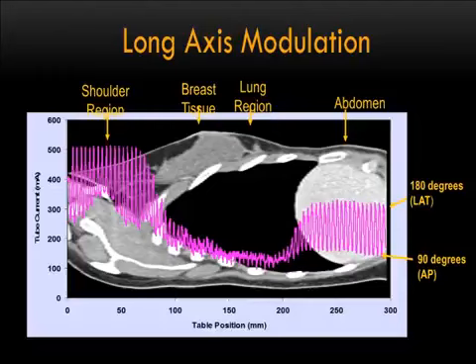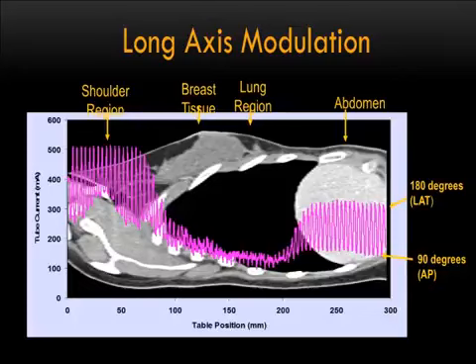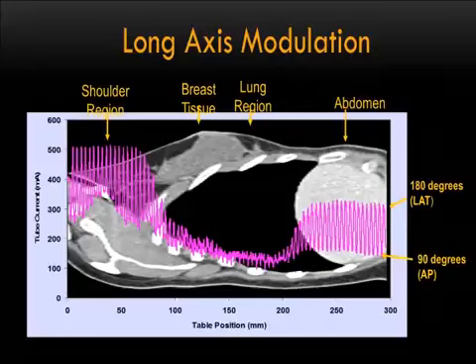And what happens is, this is what ends up happening. This is from a Siemens scanner where we actually got a hold of the actual mA instantaneous data and plotted it versus a sort of longitudinal sagittal view of this patient. So you could see how much it varies. Okay? This isn't readily apparent on the scanner. It's not displayed to you. In fact, I'll show you what is displayed in just a moment.